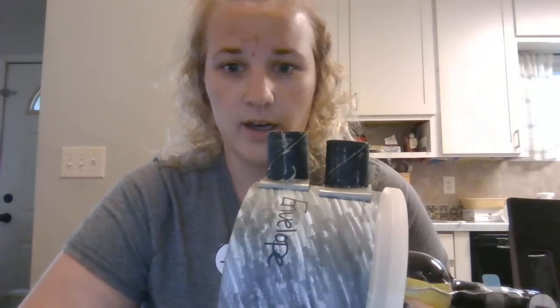And so, like I said, the envelope needs to maintain a high vacuum. The air is removed from this whole ice cream bucket so that the electrons flow from the cathode to the anode without meeting any gas atoms like air. So this just helps increase the productivity of the tube.